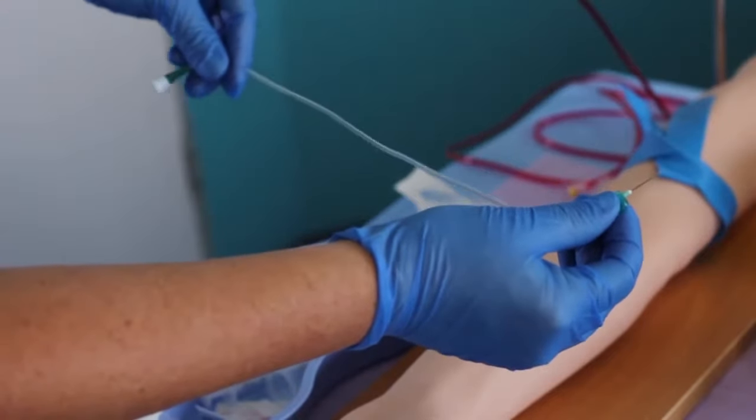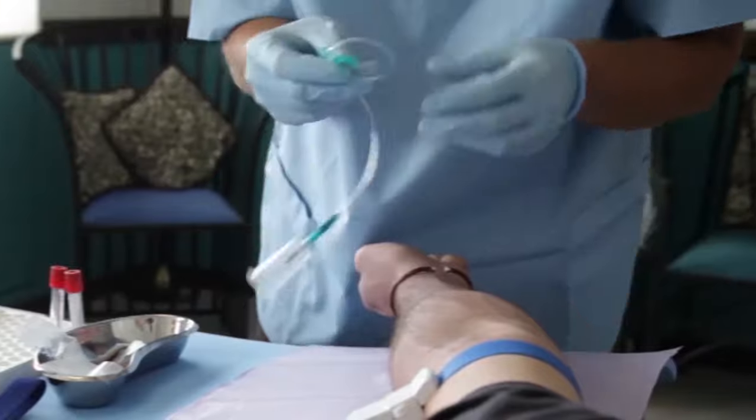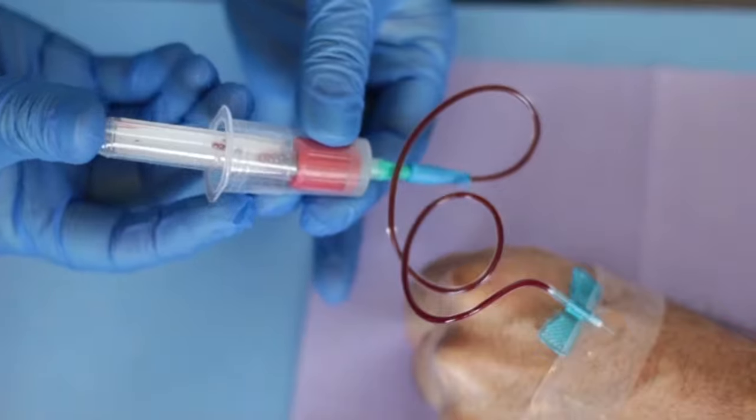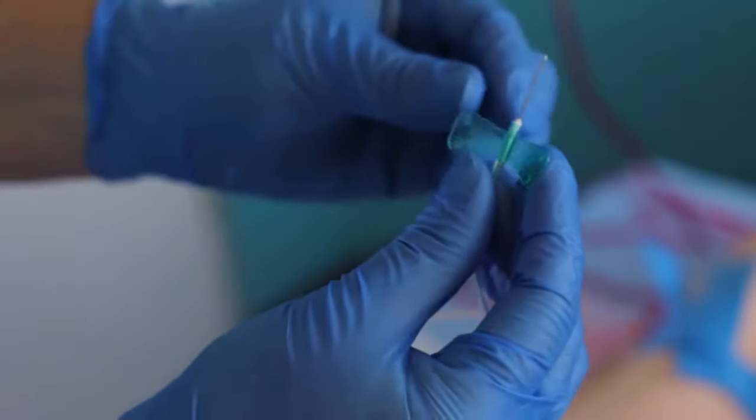Firmly attach the free end of the butterfly needle tubing either to the vacutainer hub or to the syringe. In this demonstration, the phlebotomist will use a vacutainer hub and a 21-gauge butterfly needle.